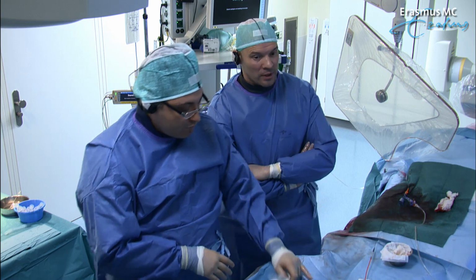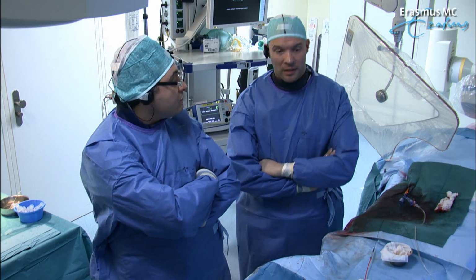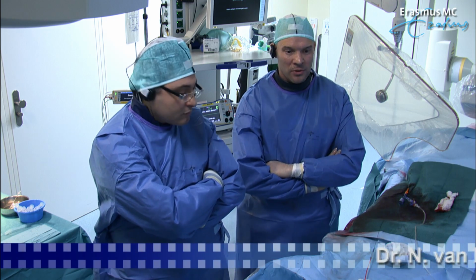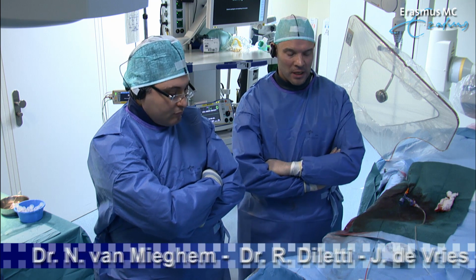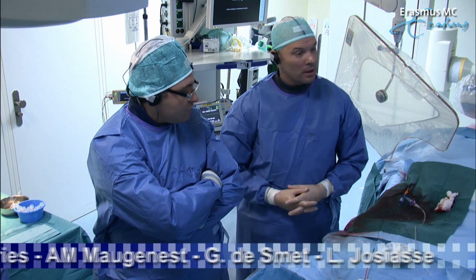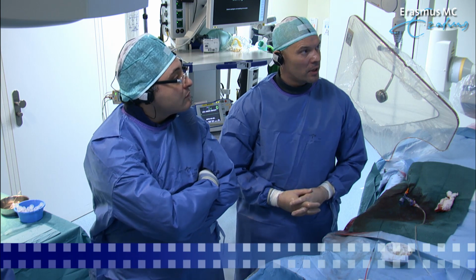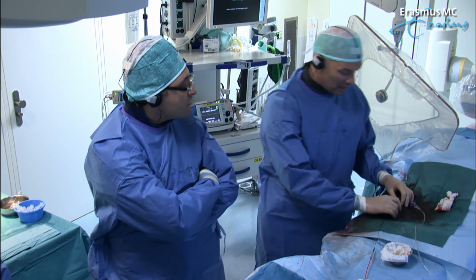We demonstrated that there is new FFR technology that facilitates the execution of an FFR, and it tackles the issues that remain with current wire-based FFR technology. The procedure itself went very well. We are not quite done yet, we are finalizing our case, but this will definitely end up being a perfect result.